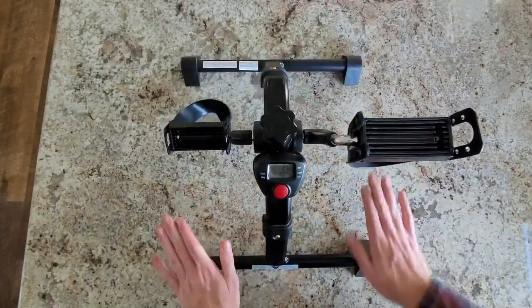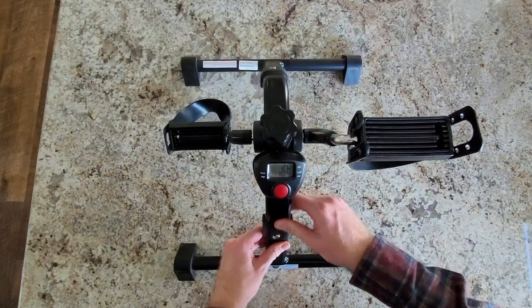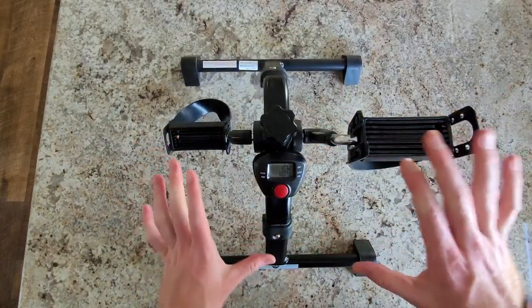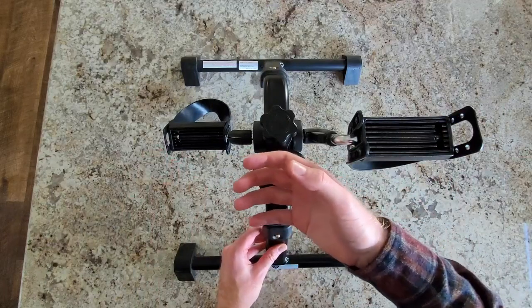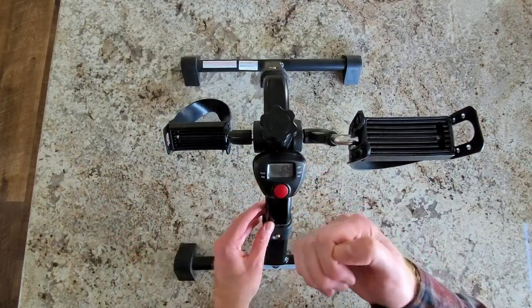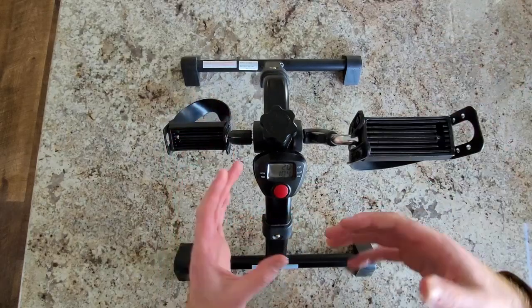There are also these grips at the legs that'll keep it stable. This is a very slippery surface here, and even me moving it, it is not slipping, which is very good. It also comes with a rope to attach to the seat that you're sitting in, for example, to hold it in its spot so it doesn't push forward. You can make it very stable.